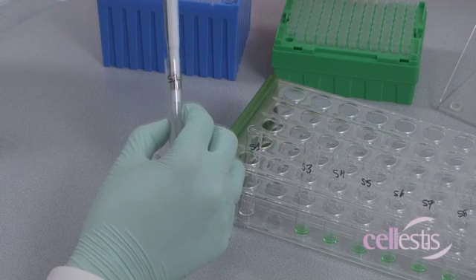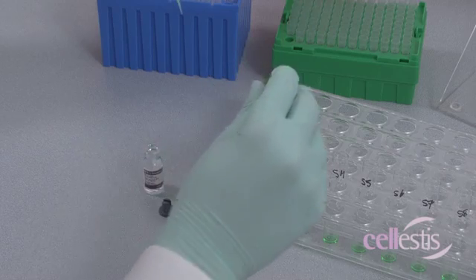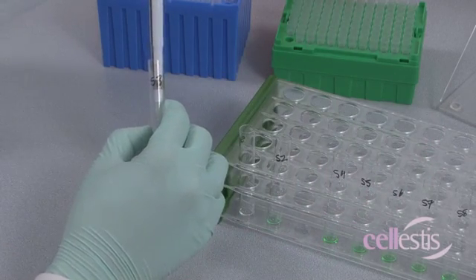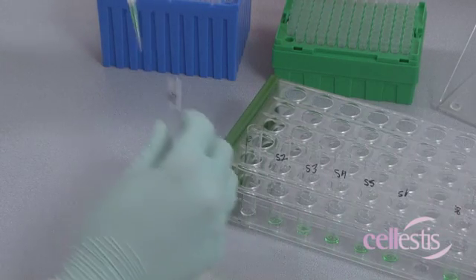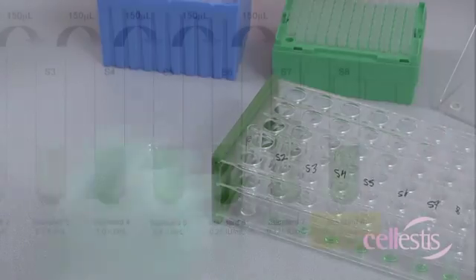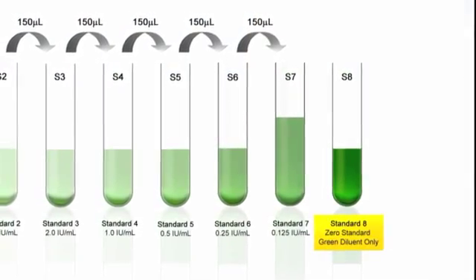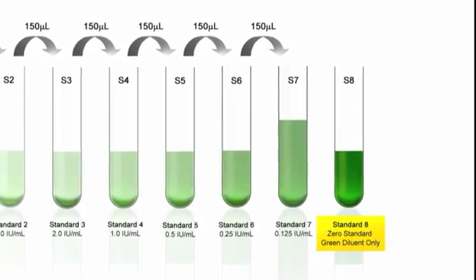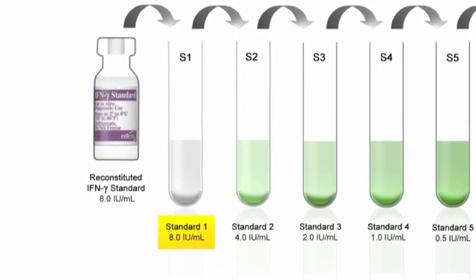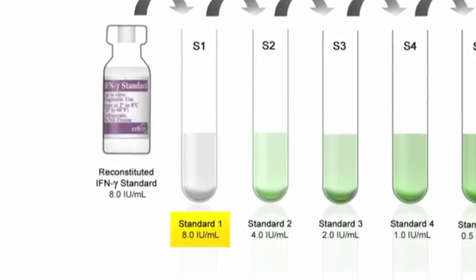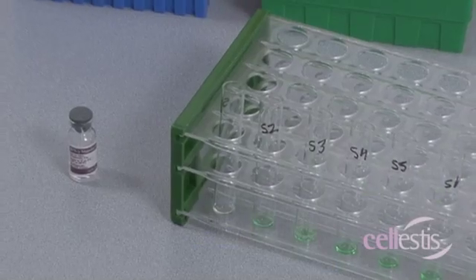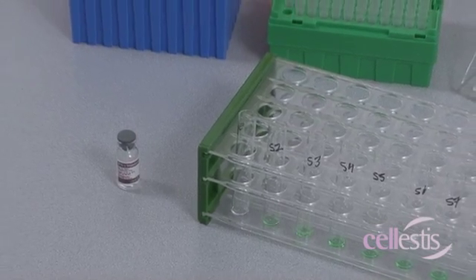Add 150 microlitres of the kit standard in S1 to S2 and mix thoroughly. Then transfer 150 microlitres from S2 to S3. Mix thoroughly and so on until you reach tube S7. Remember not to transfer anything into tube S8. It contains only green diluent as it serves as the zero standard. The undiluted kit standard in S1 serves as the highest concentration at eight international units per milliliter. Set the standards aside for use in the ELISA reaction steps.